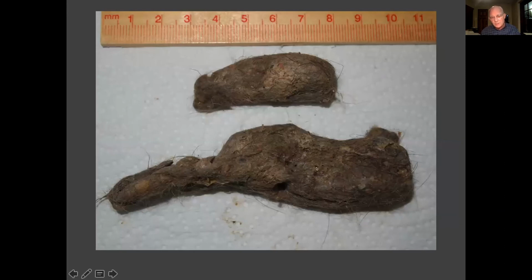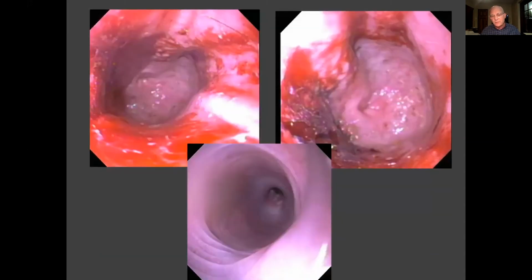Together. Sometimes these hairballs are so intertwined that they will come out as a clump. Other times they do not. The other aspect in a different case, and I would consider doing this, here's after we removed that, there was quite a bit of damage. And I don't know if this cat having this persistent right aortic arch and having maybe not as good motility in this area actually was beneficial to us in being able to get that hairball out as a whole.